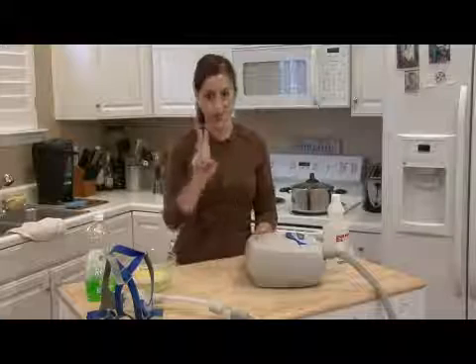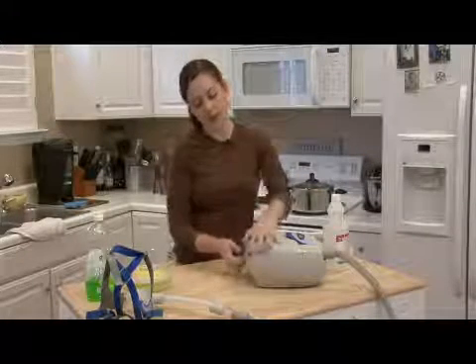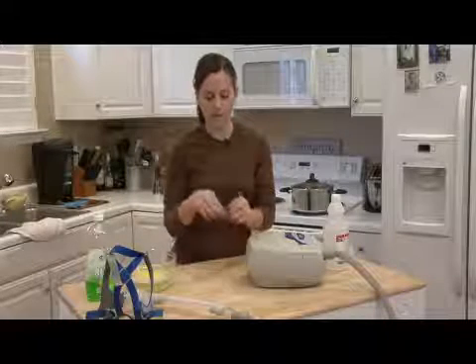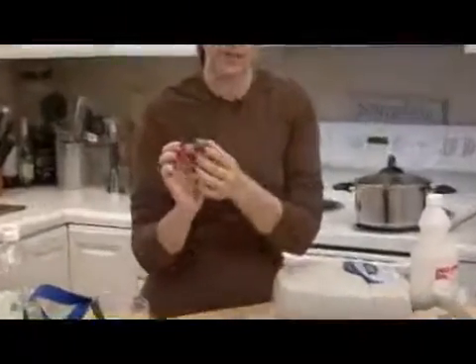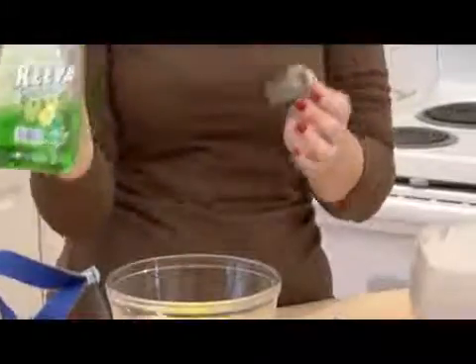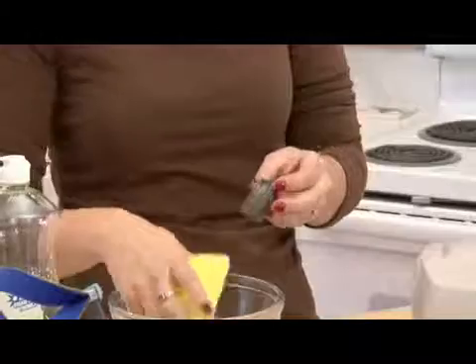So there's 2 filters in it, is the first thing you need to know. The filter on the outside is this one. You can get to it and see it very easily. It's usually a little black or colored, spongy looking thing, and it'll have just a little bit of dust on it like this does. You just want to clean it with some very mild soap. In this case, I'm using a really mild dish soap, or you could use a really mild hand soap, it doesn't matter, with water.